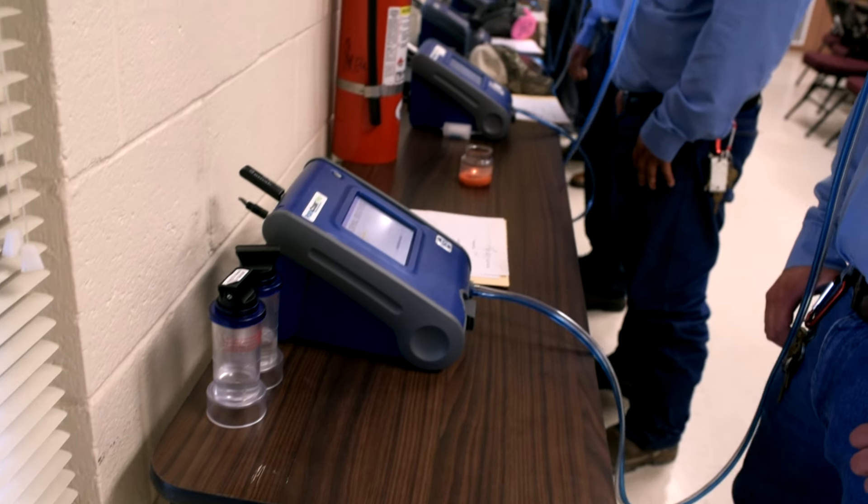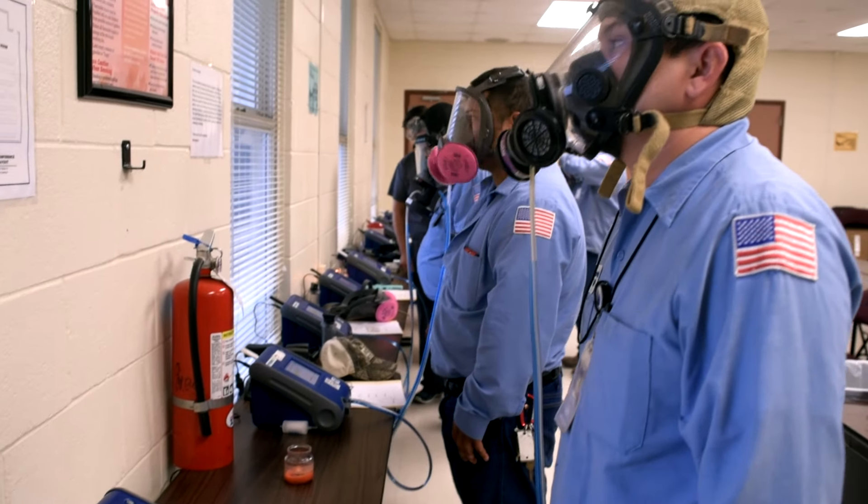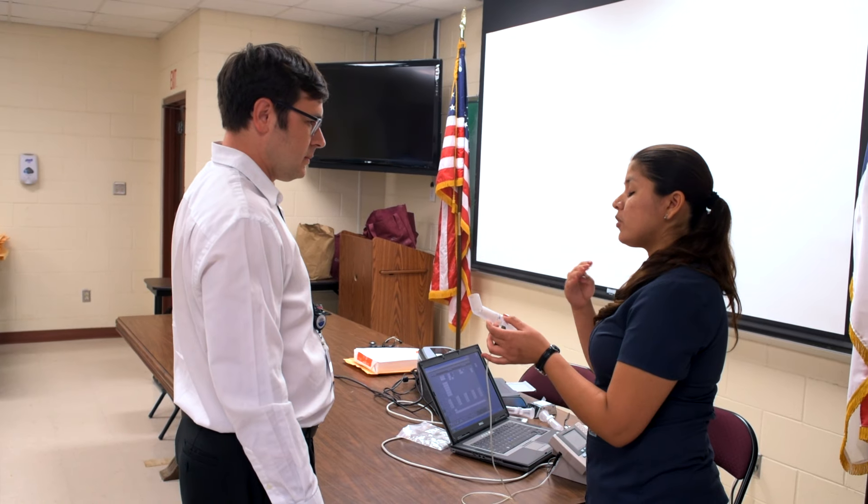The first thing that needs to be done is to ensure all workers are medically able to wear a respirator. This includes taking the blood pressure of each person to be tested, followed by a pulmonary function test.